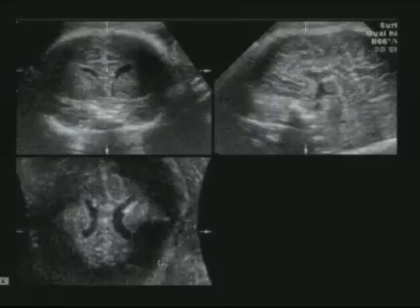Now here's another fetal head, which shows you that we can scan in this view. That's the acquisition view showing you the lateral ventricles here. We can also scan at right angles to it, and in this case we're seeing the corpus callosum. But this view, which is the axial view, very much like a CT or an MR, is a view that we can't scan in. We can only reconstruct it. We cannot, in this particular fetus, actually come in and get this picture directly with 2D.